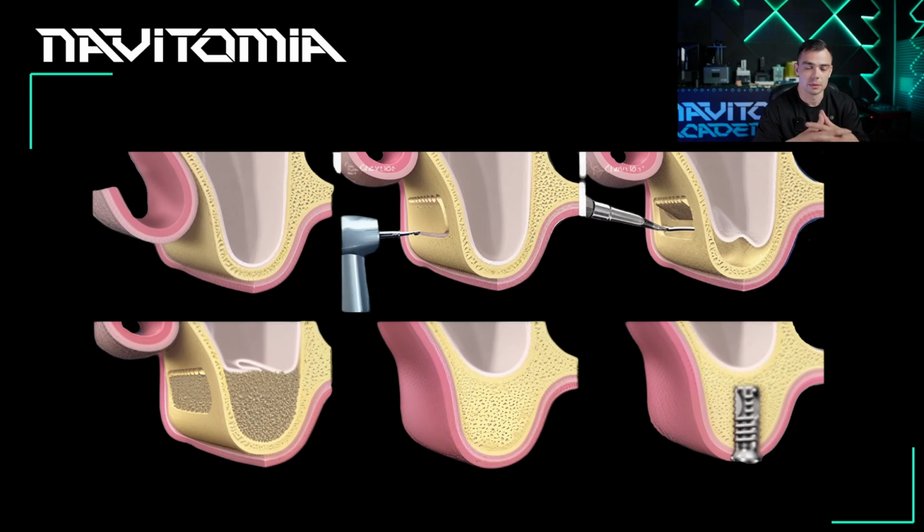On your screen you can see the scheme of open sinus lifting, how it is performed. Let me briefly explain. Firstly, the surgeon has to make a flap here. Secondly, the surgeon makes some kind of a hole at the lateral side of the maxillary sinus.